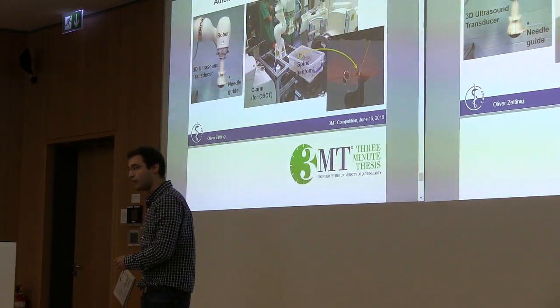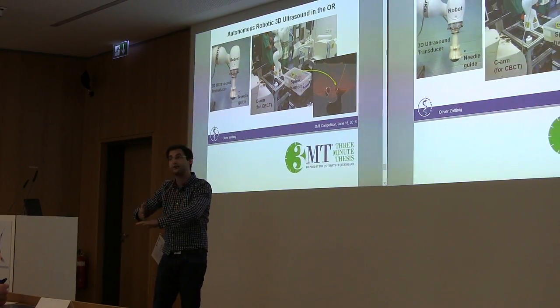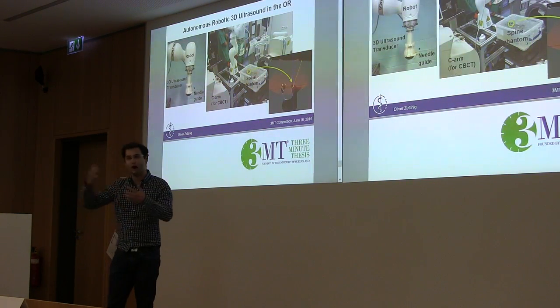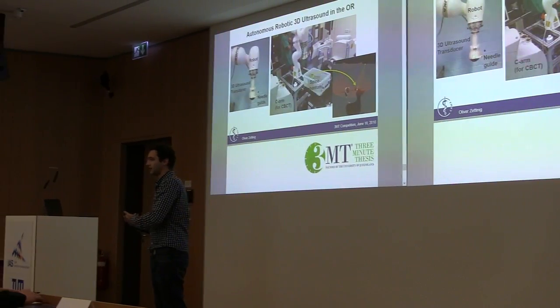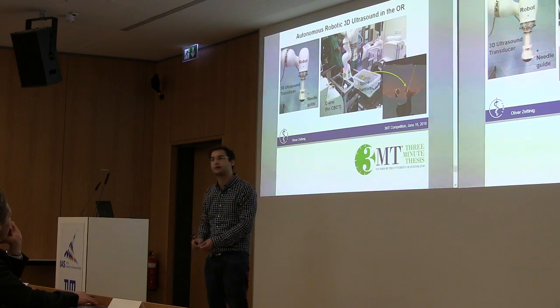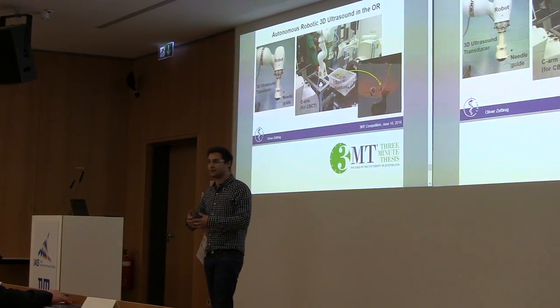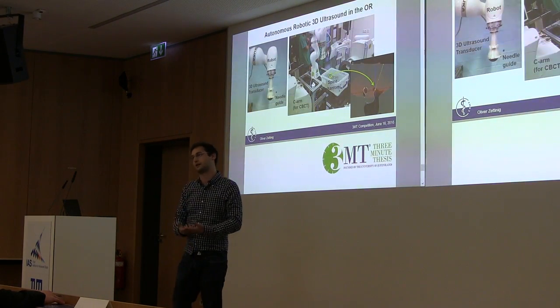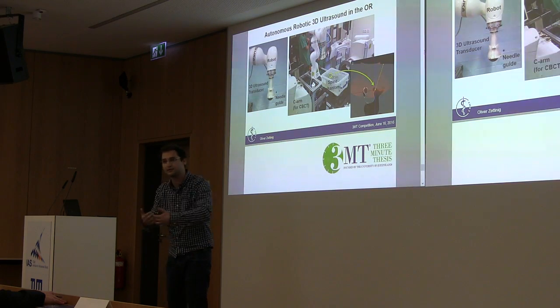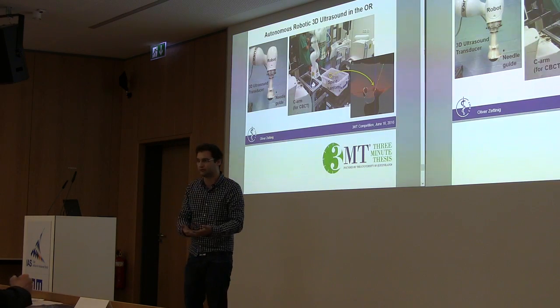So these robots can autonomously acquire ultrasound sweeps. They sweep over the anatomy and take 3D ultrasound scans. And we can then first map preoperative planning data, CTs, MRs, whatever, onto the patient lying on our table. So we know, okay, that's my target and that's where I want to go. But these robots can even do more. They can track the target in real time. They constantly take images and we perform registration, so we compare these images against the previous ones, and if something moves, we can compensate for that.